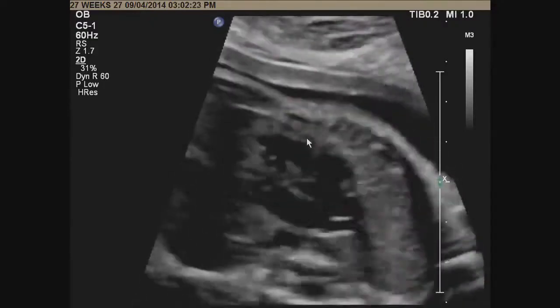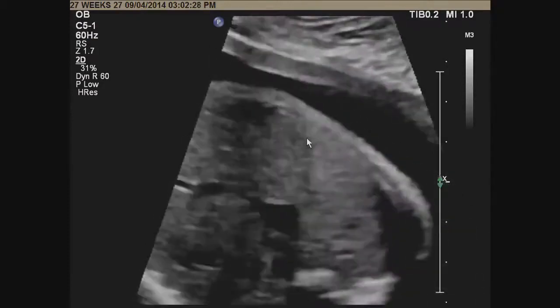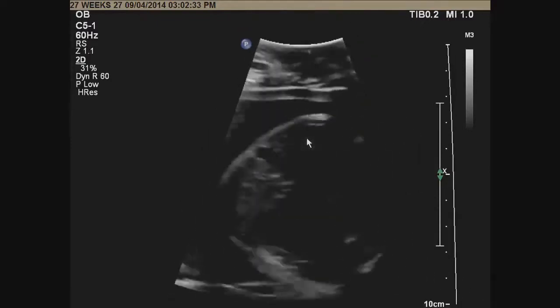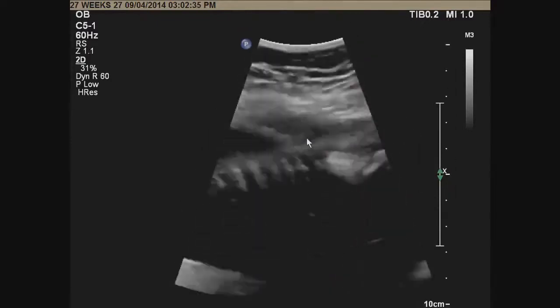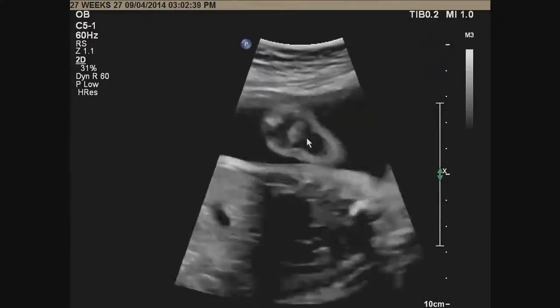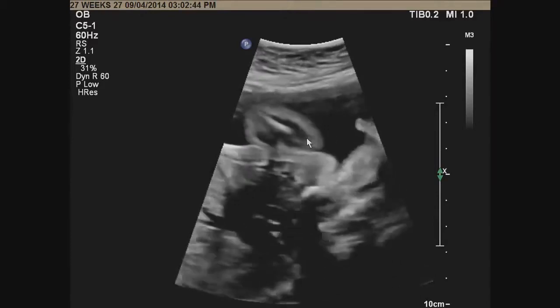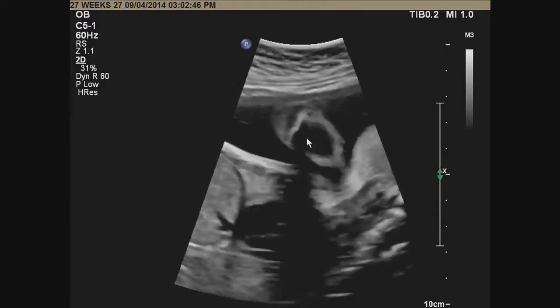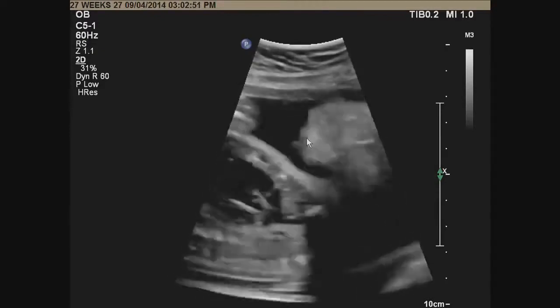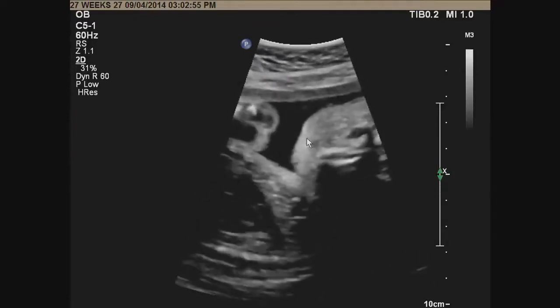So the baby is helping me now. And so now that allows me, let me just magnify a little bit less, because I want to work on the arches. To see the aortic arch structure, I need to be in an almost sagittal view of the spine. So I'm going to try to come in from mom's side. And here's your aortic arch right here, even on grayscale. You see the nice curvature, nice size throughout, and you see the right pulmonary artery coming right under it. So this is the ductal arch view here.